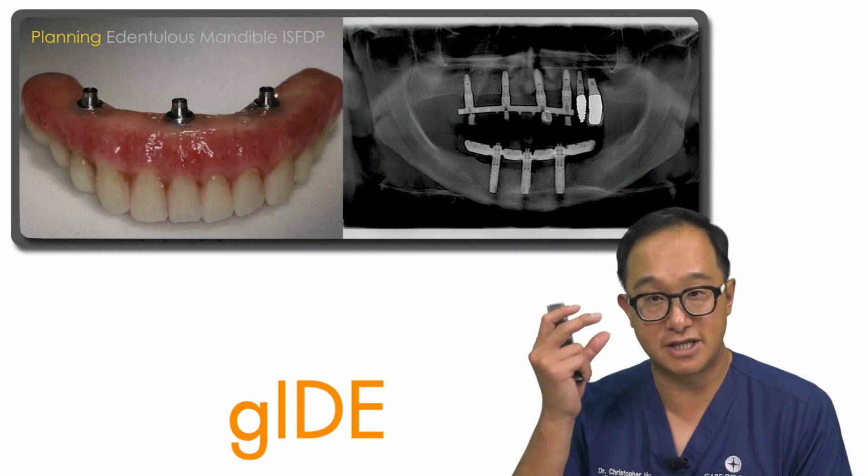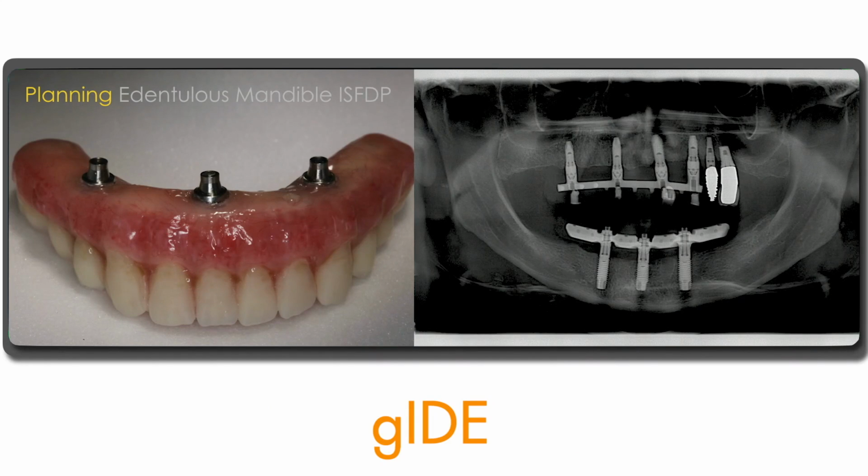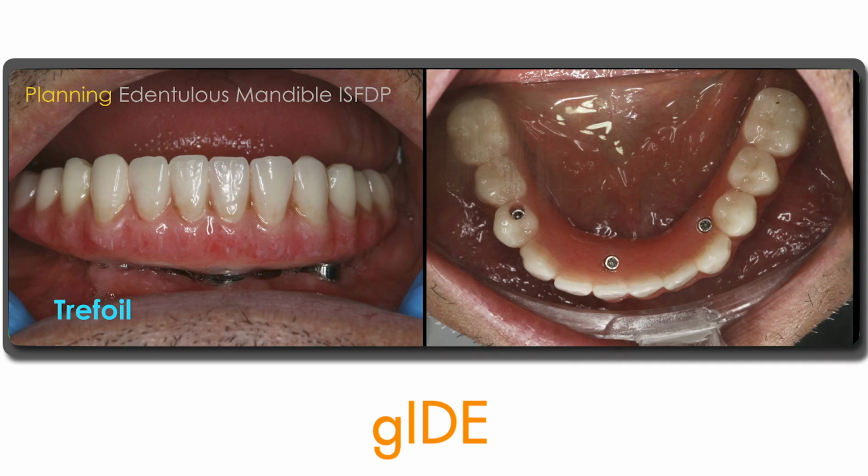So this patient walks out with this trefoil prosthesis in place with 3 implants in the mandible and a full arch fixed prosthesis. So that's what it looks like in the mouth, and we want to have some space for cleaning. Now, in the maxilla, we wouldn't do this, but in the mandible, the patient can clean more effectively with some spacing that's been left intentionally underneath the bridge.